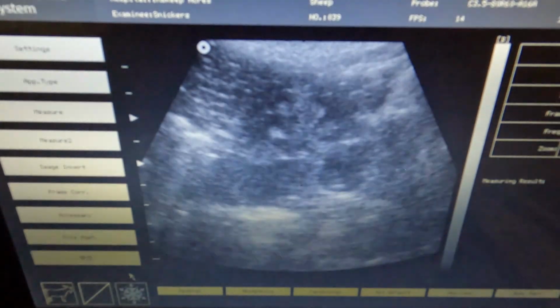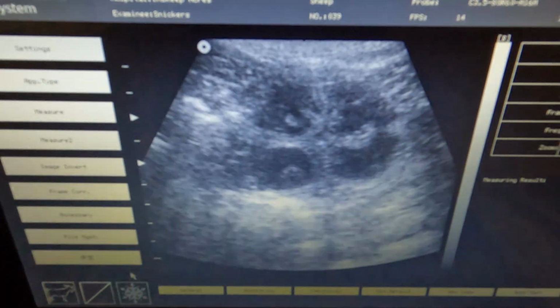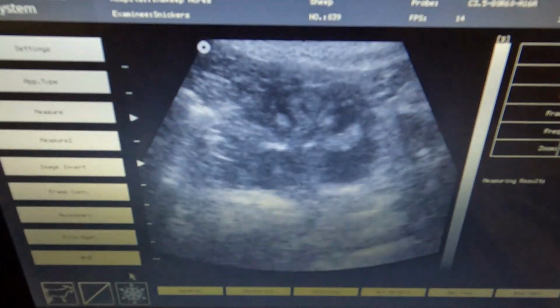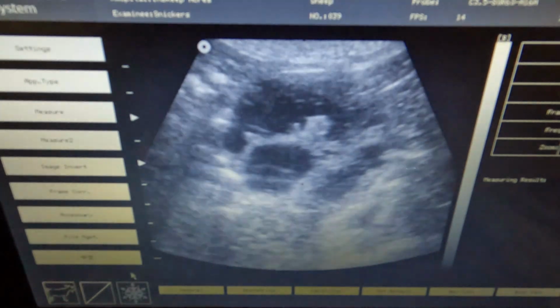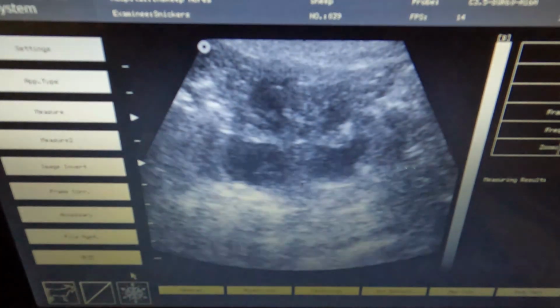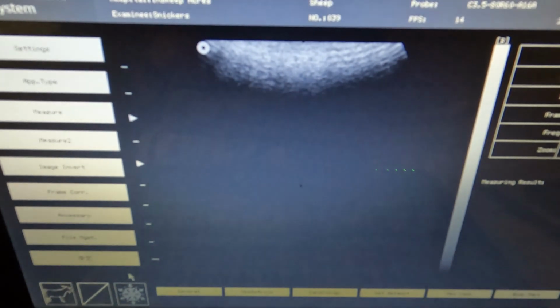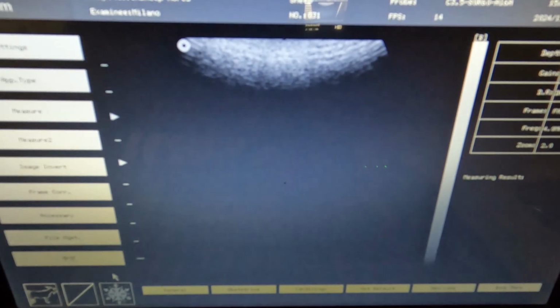Hold on, hold on. I'm pretty sure that there is movement in all 4 of those bubbles. Looks like there's a good possibility that Snickers has 4. Okay, Bud, I believe about 35 days. And I thought maybe 3 to 4 last week.